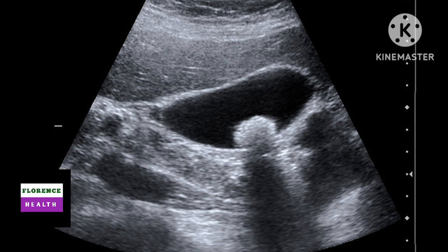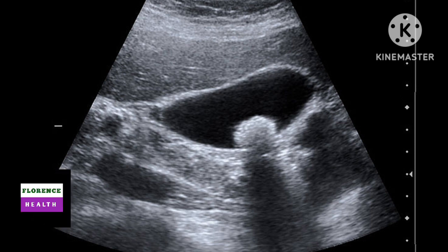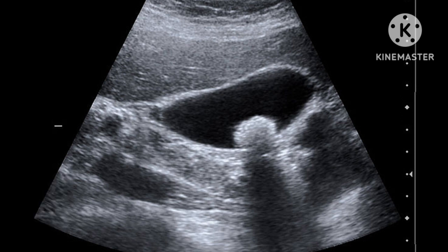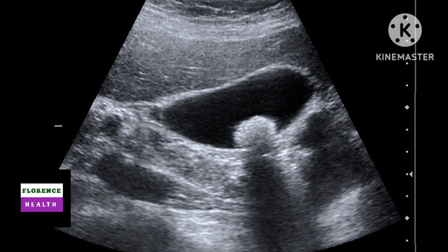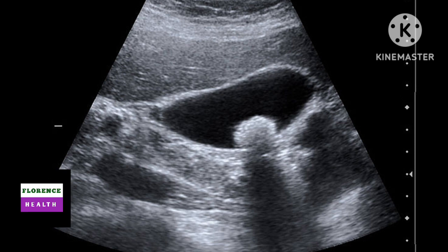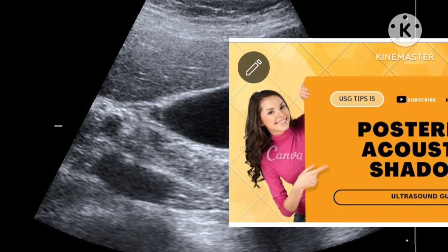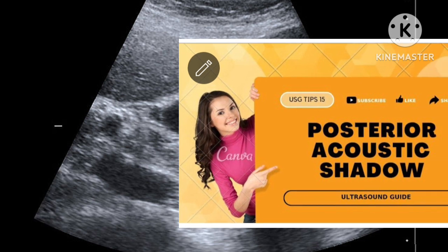Stone and very rarely sludge produce posterior acoustic shadow. But in other cases like blood, pus, or milk inside gallbladder, and pigmented stone sludge, they never produce posterior acoustic shadow. Polyp and growth inside gallbladder never produce posterior acoustic shadow. This slide shows an echogenic structure having posterior acoustic shadow due to the stone itself.